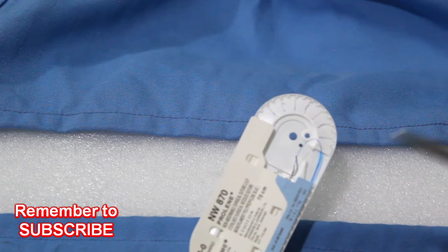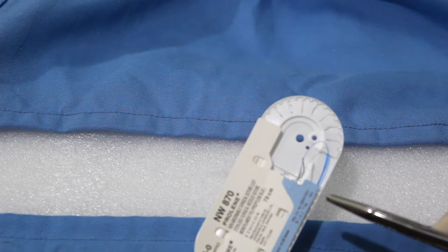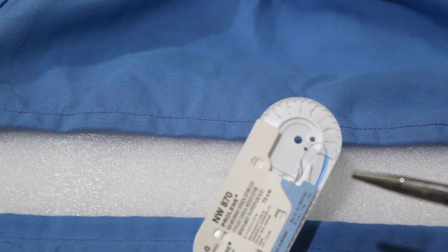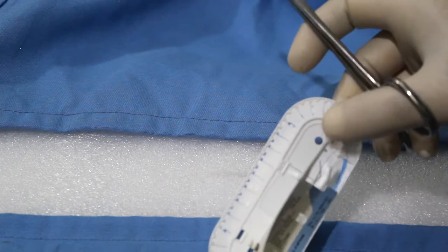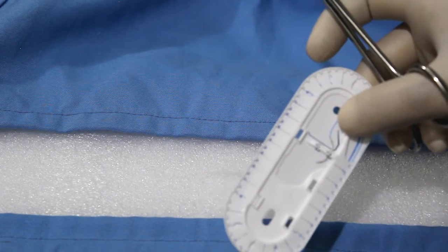The advantages of prolene are that it won't lose tensile strength over time, it has good knot security, very little tissue reaction, and high plasticity. The disadvantage is that it will stretch when pulled, and it loosens when edema subsides.